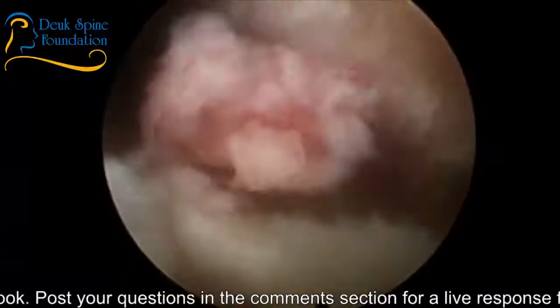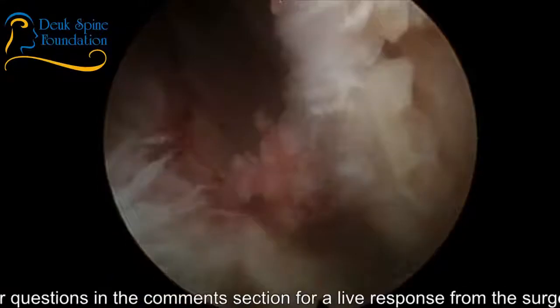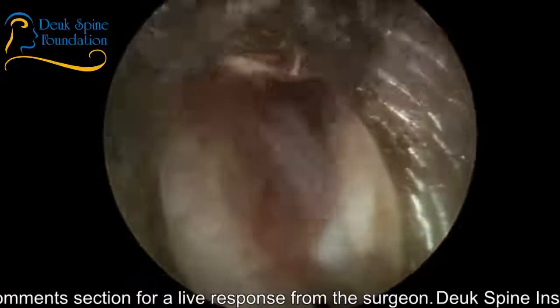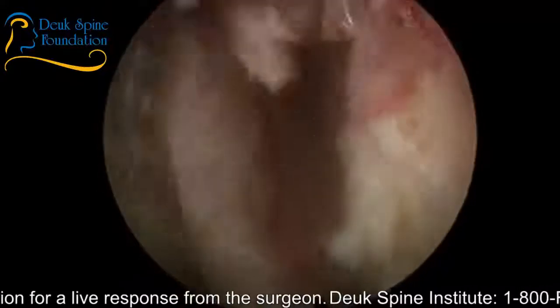How does it look? This is the one that we repaired, that we sent out. The scope? Yeah, I just want to make sure it's fine. I think it looks pretty good. There we go.